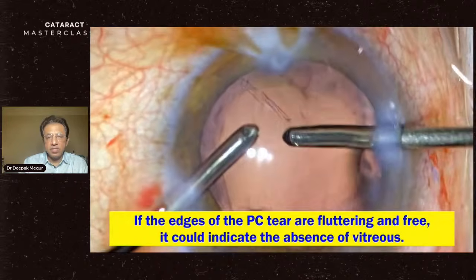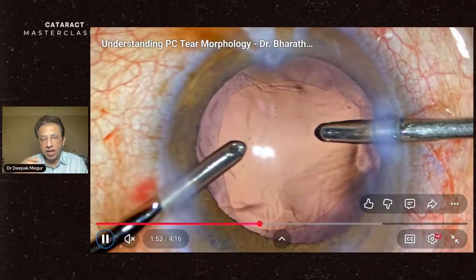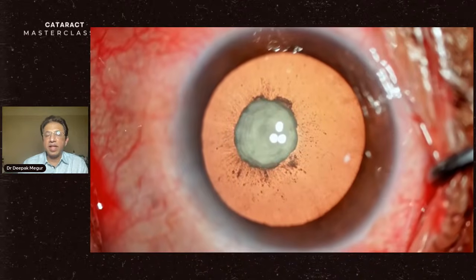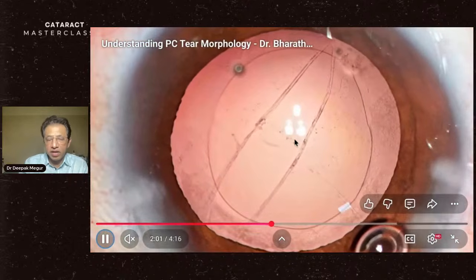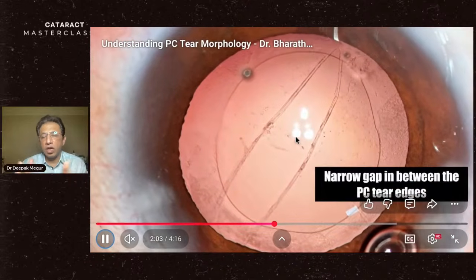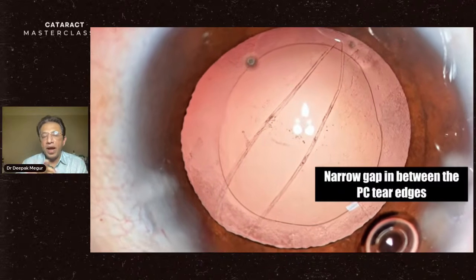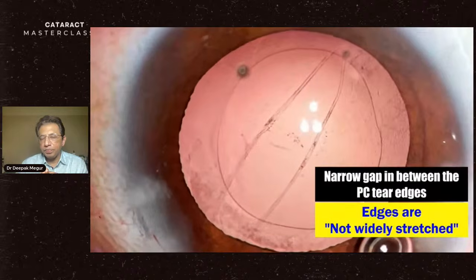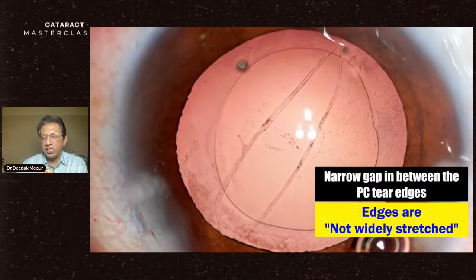The third sign is if you see the flap of the posterior capsular tear freely fluttering, just waving with the fluid there, that indicates that the anterior hyaloid is intact. You can see again the edge is fluttering here. The edges are not widely splayed. There is a narrow gap between them. We can fairly conclude that the posterior capsular tear is there, but the anterior hyaloid is still intact.